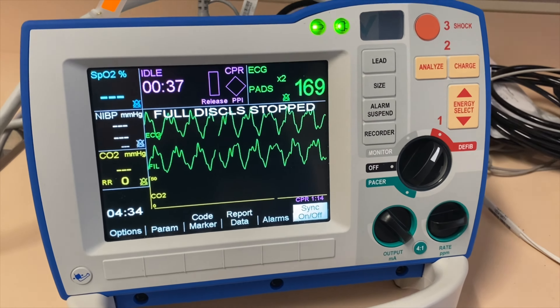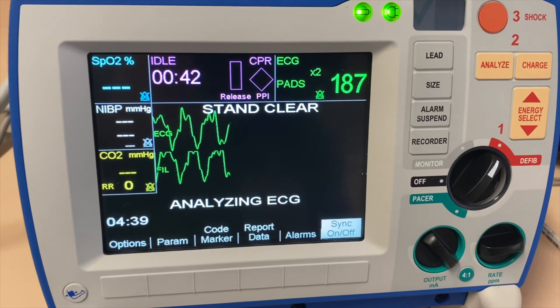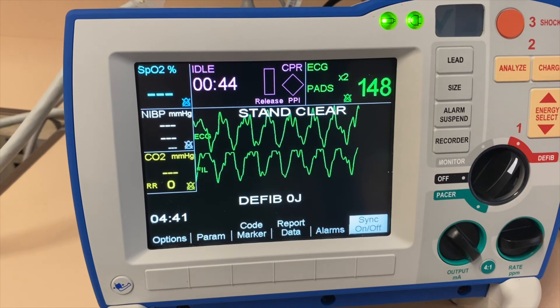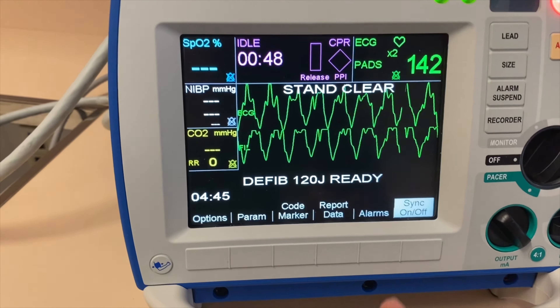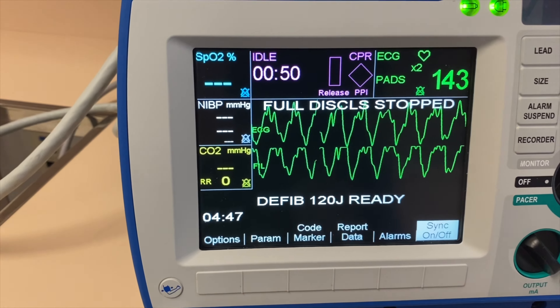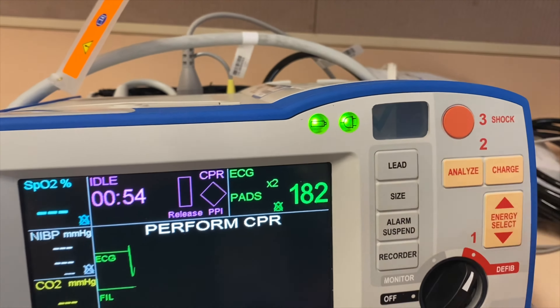If we want to give a shock or defibrillate this patient, the first thing you want to do is put this on AED mode and click Analyze. Stand clear — I'm clear, everybody clear. Note the dose that was delivered. Press shock. Perform CPR.